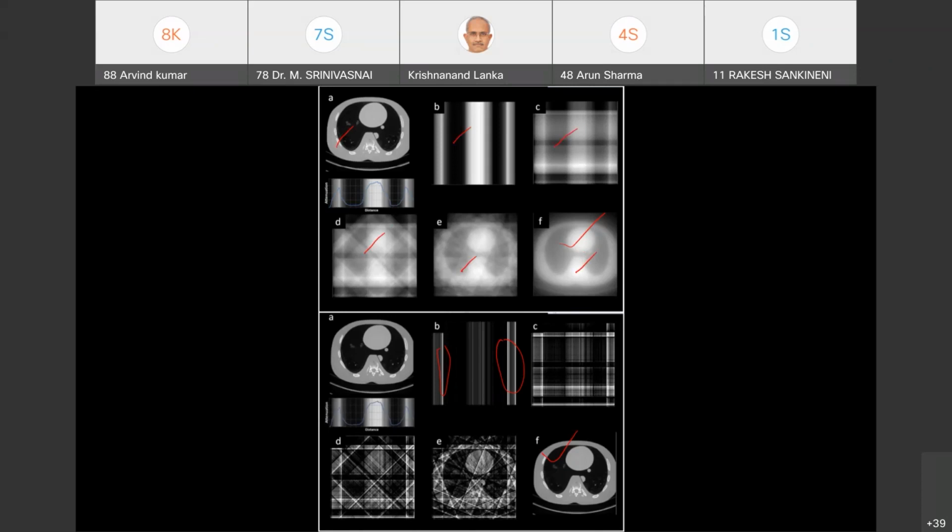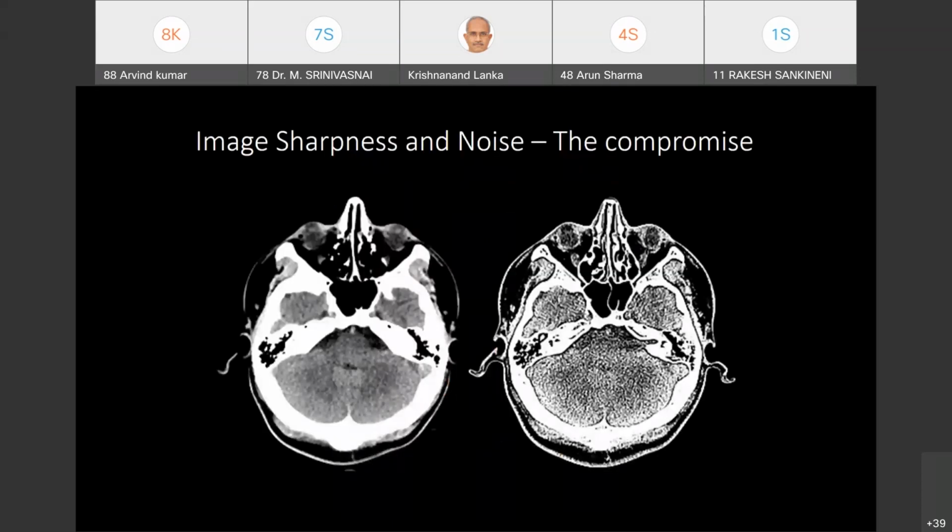In the second case, since you have used various filters and removed all that noise in each of those projections, you got a very sharp image here. That is how you generate each slice information like this.